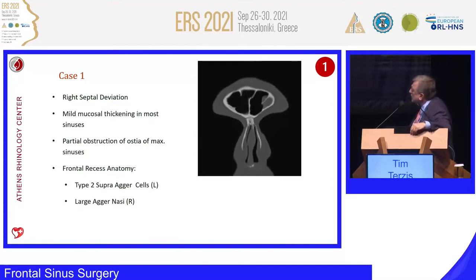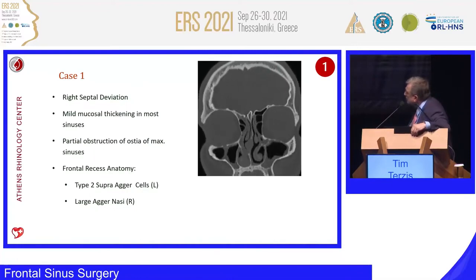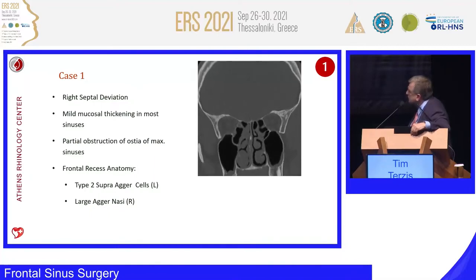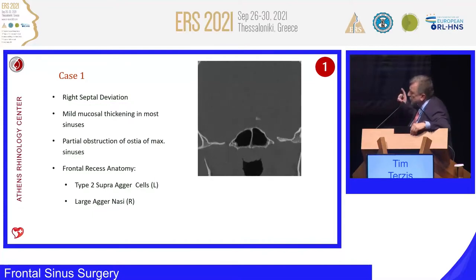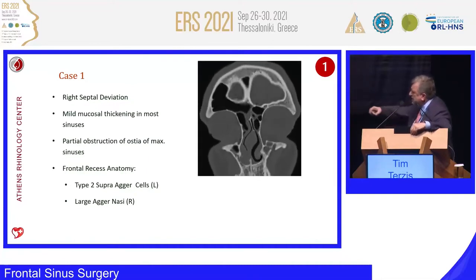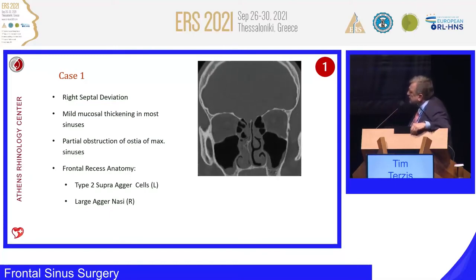Yeah. Tim, just a comment. I would maybe go for endoscopic septoplasty, doing just a little incision, and going for this. It depends how it looks when you make endoscopy. Well, the extension of the spur is quite large, actually. It's not just a little spur. The length is not a problem. The deviation is quite large. You can do it very nicely endoscopically.